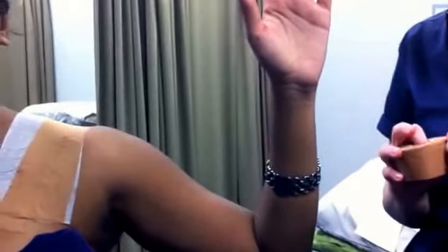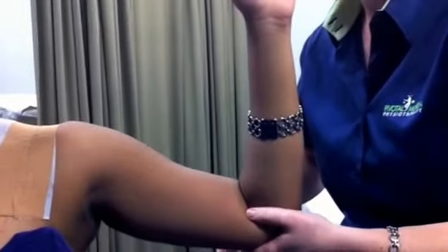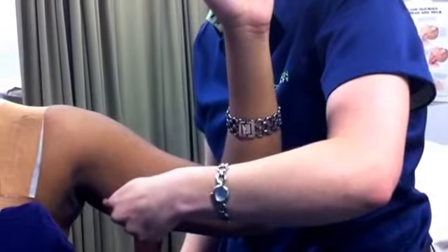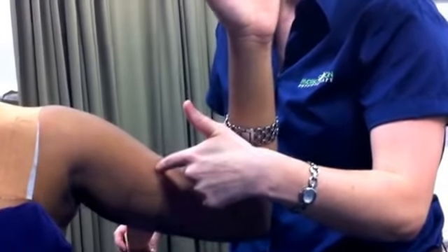For an anterior dislocation, position the arm in abduction and external rotation as shown. Begin by applying the tape over the mid triceps belly. If the patient is a chronic dislocator, you may choose to start a little bit higher.